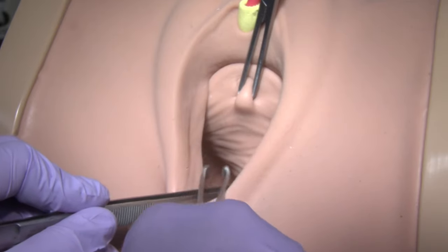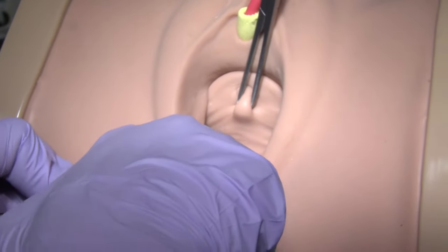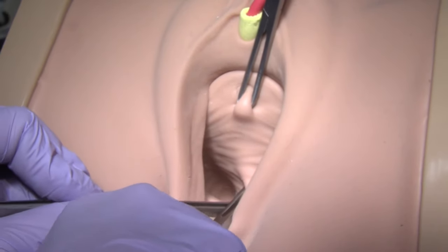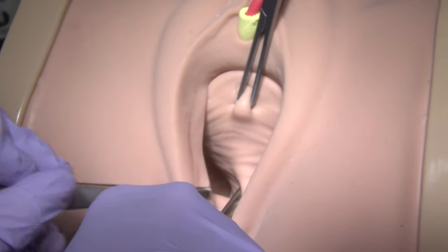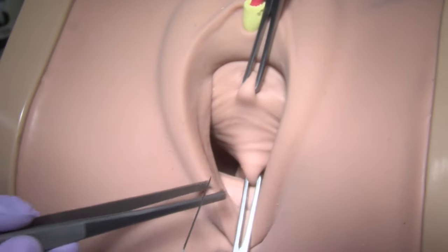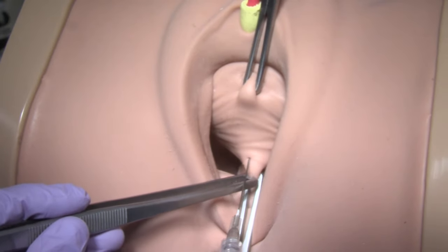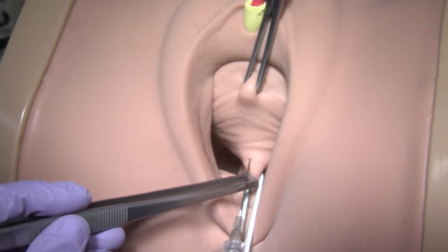Use two Alice clamps to grasp the vaginal epithelium at the urethro-vesicle junction and at the vaginal apex. Inject hydrodissection solution sub-epithelially.